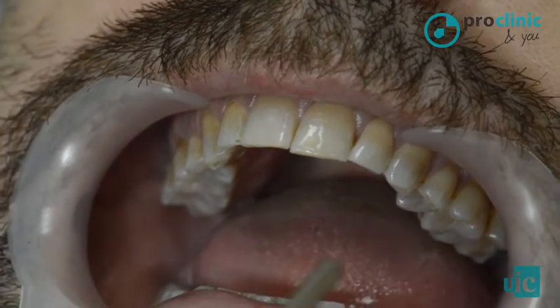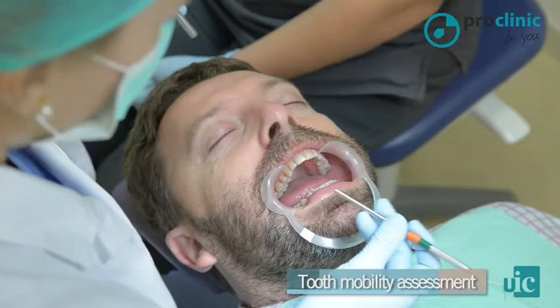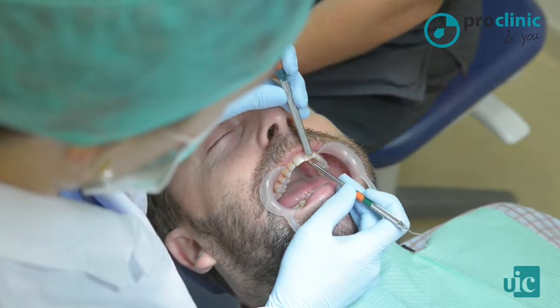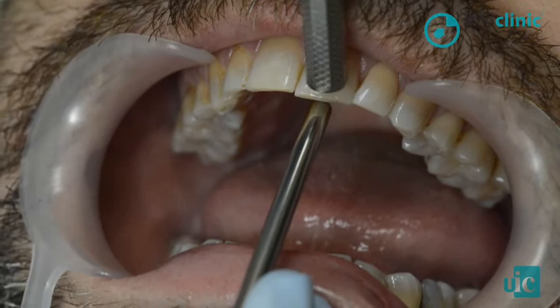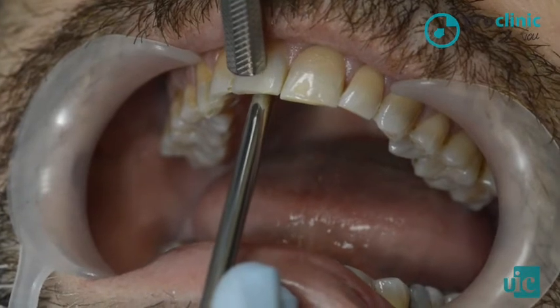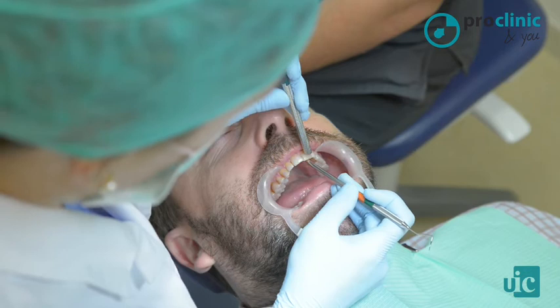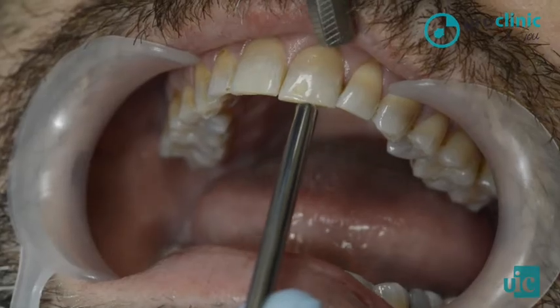Tooth mobility is assessed with the blunt end of 2 instruments, and it is classified into types 1, 2 and 3. Type 1 is when the buccal palatal lingual movement is less than 1 millimeter. Type 2 is established when the movement is more than 1 millimeter. In type 3, there is a horizontal movement and also an apico-coronal mobility.